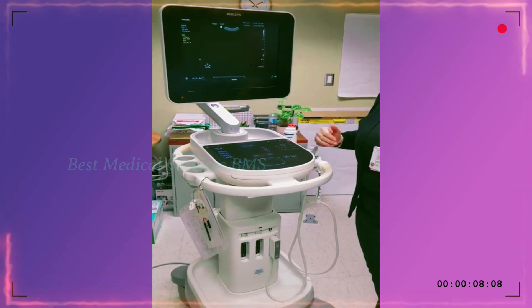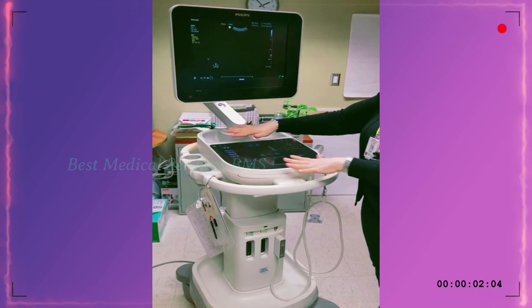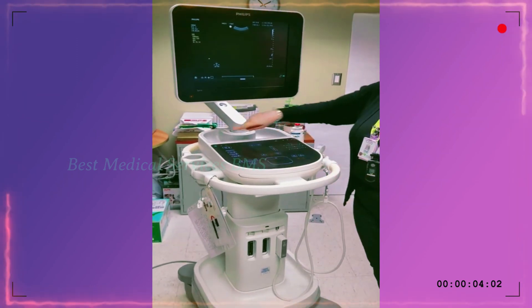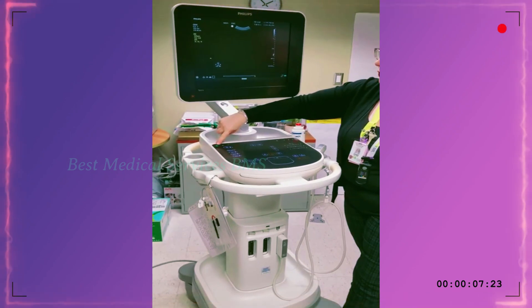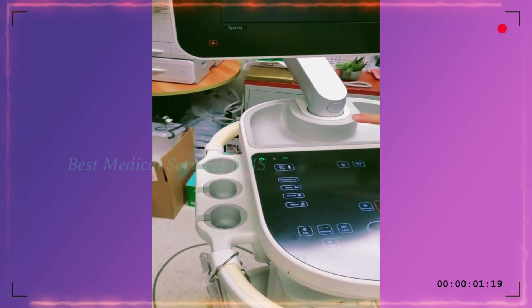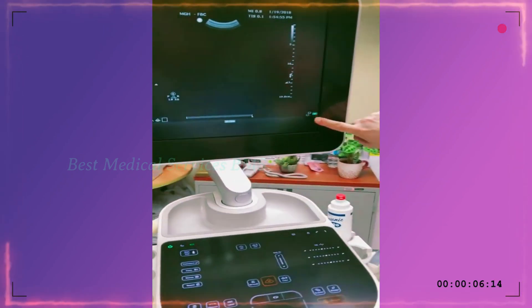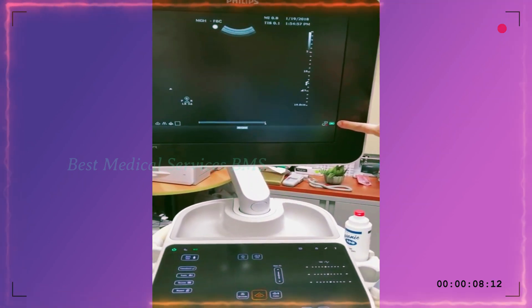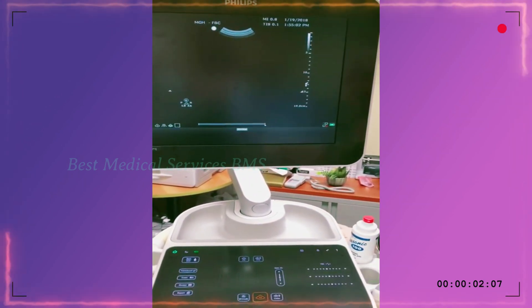The on indicator is this button here — it's a green circle with a line through it. We are going to leave the machine on and plugged in. Plugged in shows that there is a white lightning bolt through the battery. We're going to leave it on and plugged in all the time.